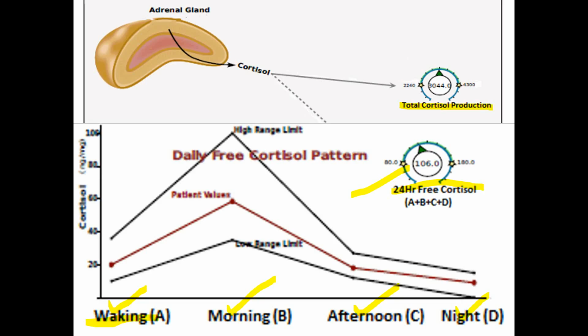Now, in this particular case, the free cortisol happens to be low. However, the total glandular output is within the normal range. So that tells you that the cortisol production is a little bit more reasonable than the free cortisol would imply. So if it's on the lower side of normal, that's going to confirm that it's on the lower side, but maybe not as bad as the free cortisol would have you think. And if it's on the higher side of normal, then there definitely appears to be decent cortisol output.